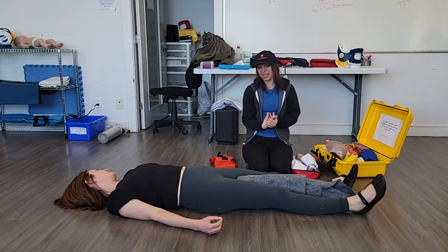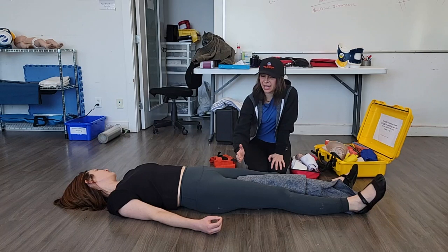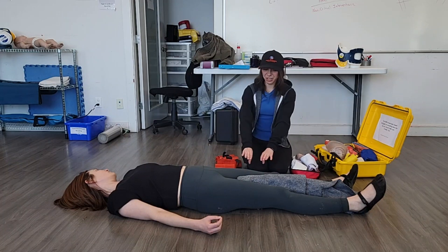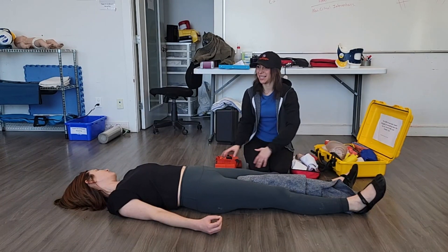Usually the idea behind this is we want to go above and below the break. But because we've got an upper third femur fracture, we can't actually get too high above that fracture with our strap. So we're actually going to put two straps below the break and then one at the bottom to stabilize the legs together.